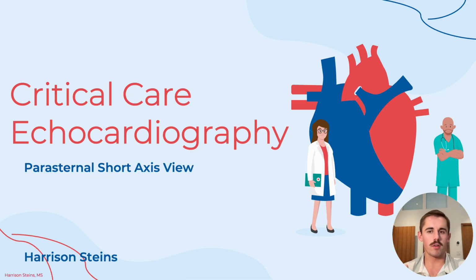So as far as clinical relevance, the cross-sectional assessment of the heart shows us ventricular function as well as septal dynamics. For application, we're going to use the PSAX view in assessing for right ventricular overload or septal flattening, and it may be the first and only clue to a massive pulmonary embolism.